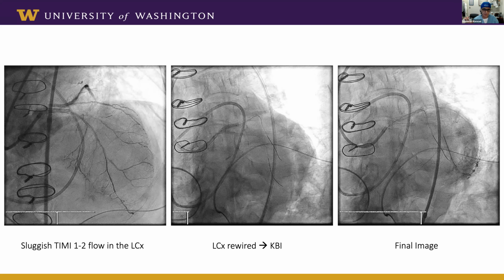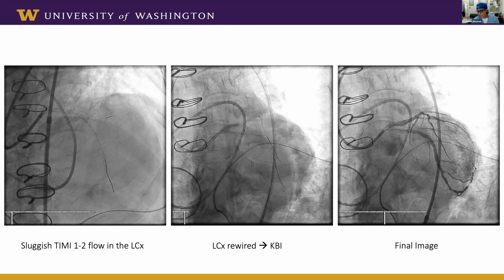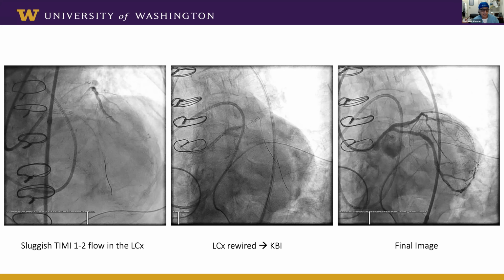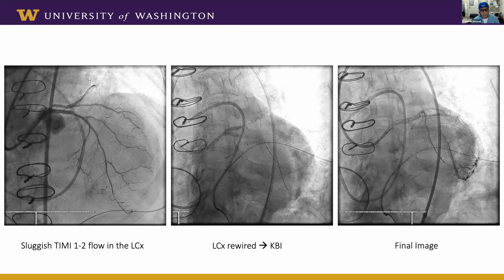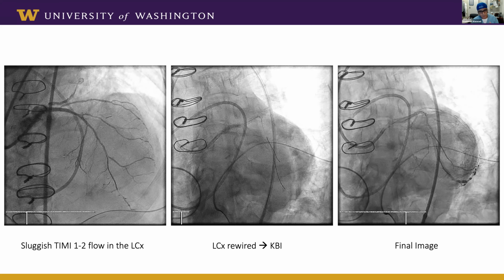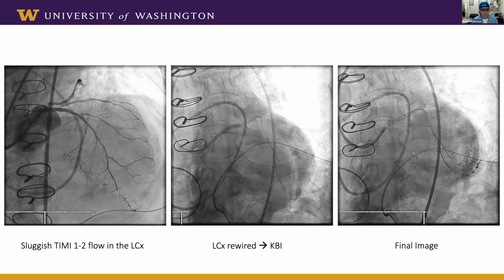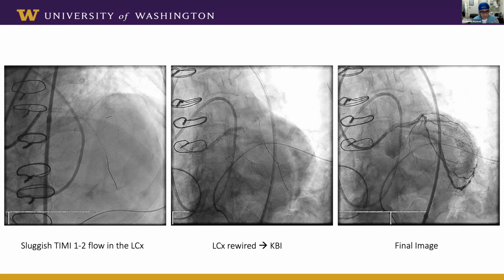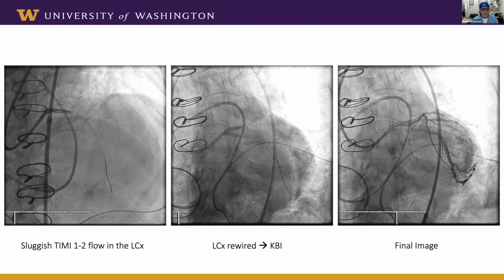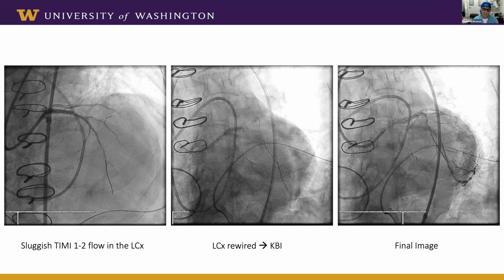This is the nightmare of the interventional cardiologists back then, before we had stents. They dilate with the balloon and they wait and wait and wait. And they go home and have to rush back in the middle of the night, patient on heparin and warfarin. There were so many trials to figure out how to keep the artery open until someone came up with the idea of a stent. So I think imaging here is the answer.